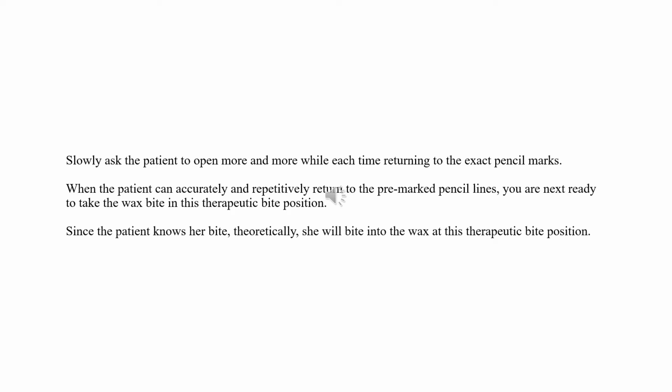And eventually they're going to learn this up and down bite at the therapeutic bite that you and the doctor determine. Now, when the patient can accurately, it means every time in the right place, and repetitively over and over and over, return to the pre-marked pencil lines, you are next ready to take the wax construction bite in this therapeutic bite position. So you're going to take the wax construction bite in this bite position.